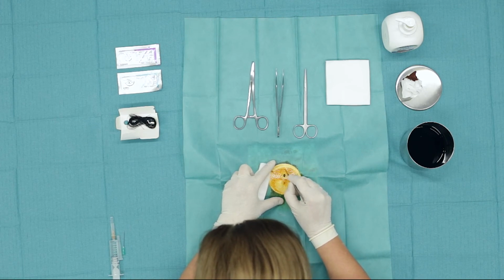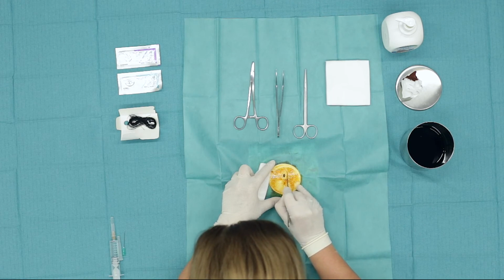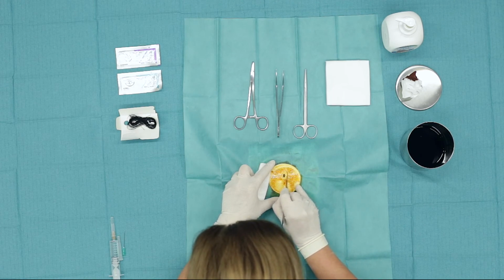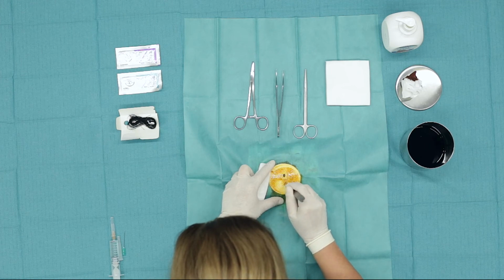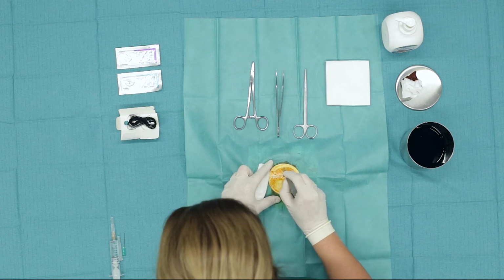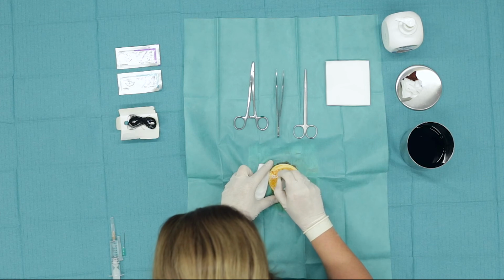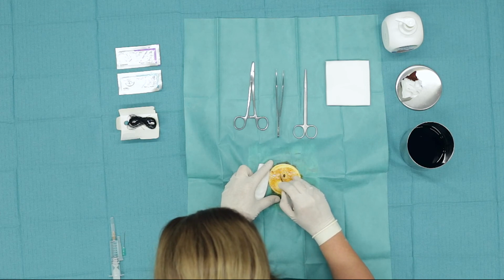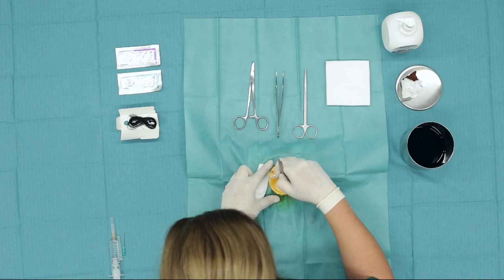While moving on, the incision is made with the convex part of the scalpel, and reaching the corner again, the incision completes with the tip of the scalpel. The same on the opposite side: tip, belly of the scalpel, and the incision completes again in the corner of the incision with the tip of the scalpel.